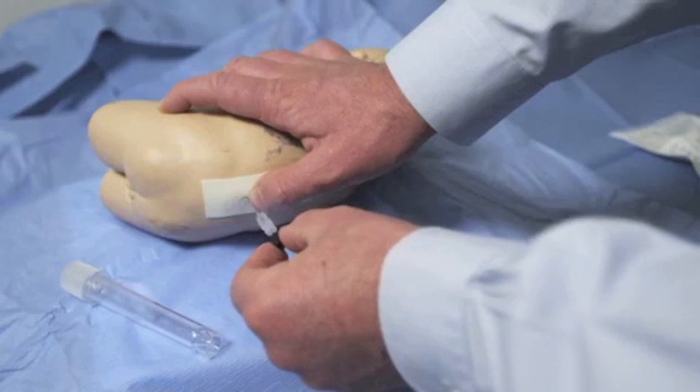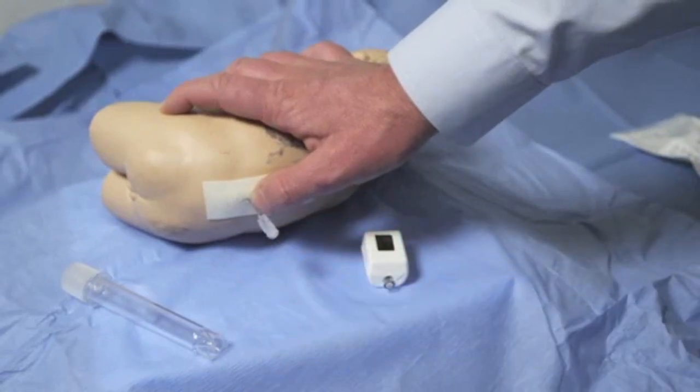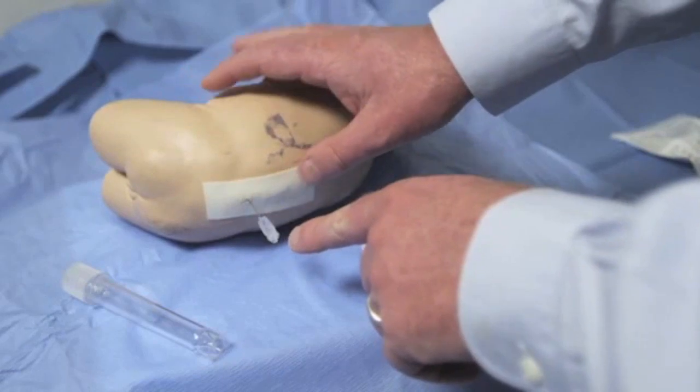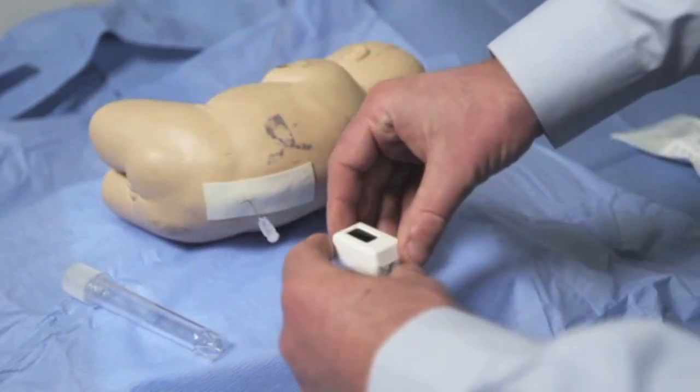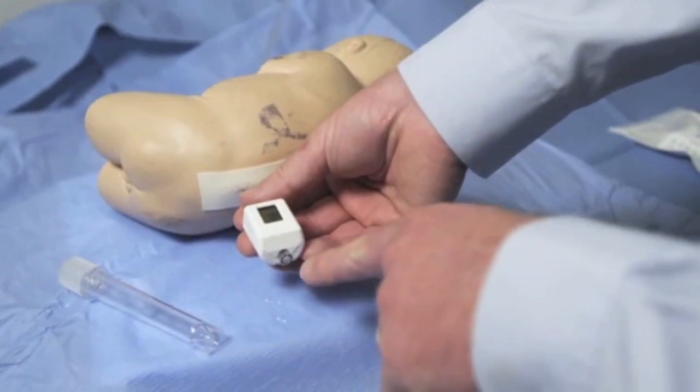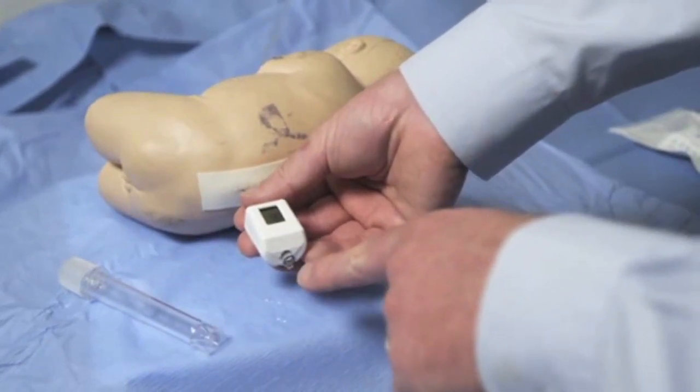Once the space is accessed and cerebrospinal fluid is observed at the rear of the needle hub, simply attach the Compass and wait until CSF is observed at the rear of the device.